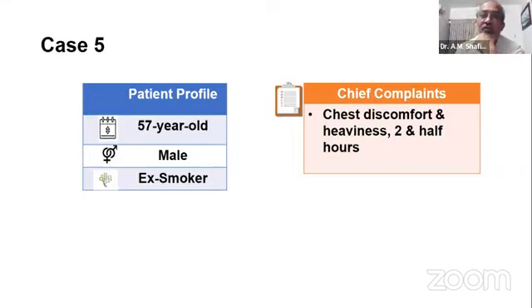T-wave inversion as well. Yeah, T-wave inversion is an anxiety. It is the ER physician. But I tell one thing for Q waves: in a chronic or semi-acute situation, Q wave is a poor man's guide for viability. I'm saying poor man's because it is not dynamic. If you don't have any other tool, then the more and more you see the Q and deep Q, the less enthusiastic you will be. But it is not an acute situation again.